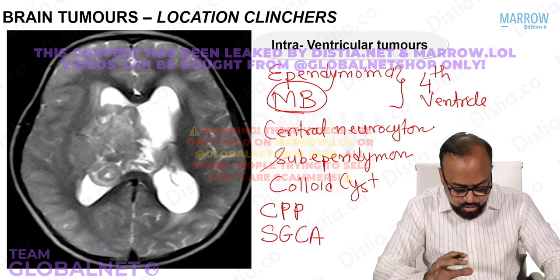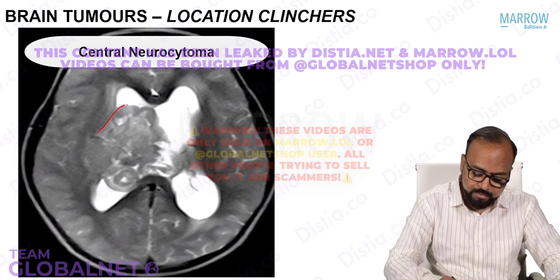Now let us look at this tumor. What is this tumor? This tumor is a very bubbly appearing tumor. See why?